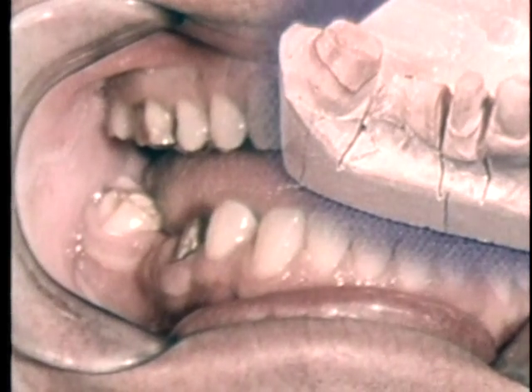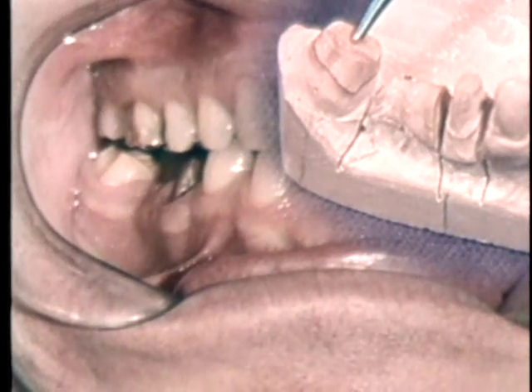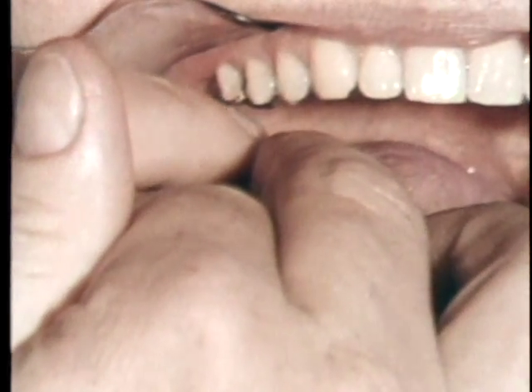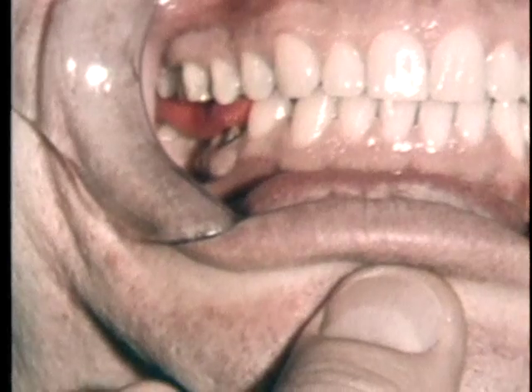Once again, a three-unit mandibular bridge has been prepared. The molar preparation is the terminal abutment. The area is dried and then coated with a suitable lubricant. This protection is necessary to minimize hard and soft tissue damage from free monomer. The soft wafer is placed over both abutments and the patient is instructed to close into his habitual or acquired occlusion.